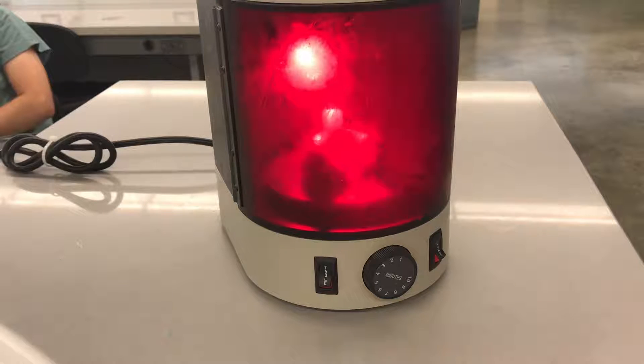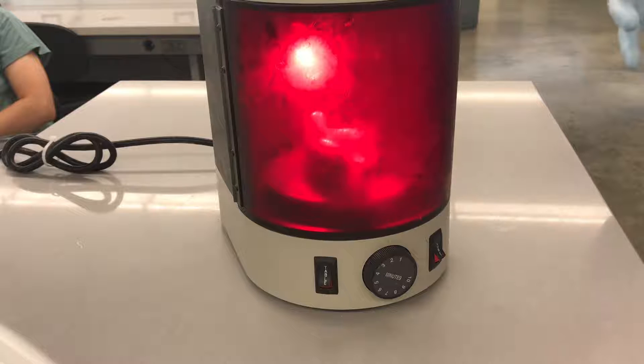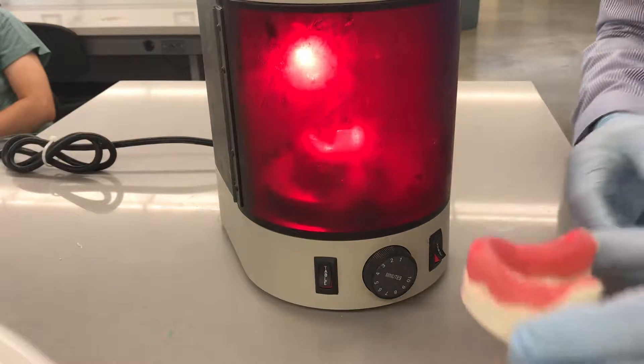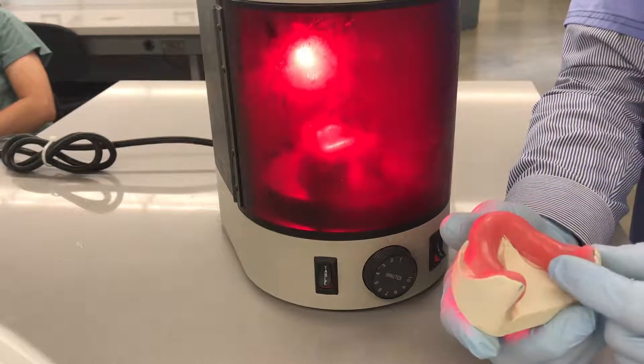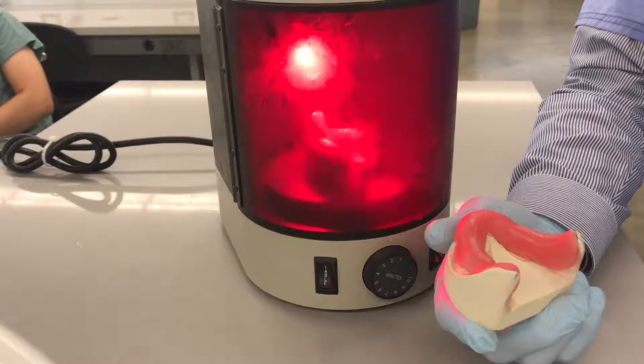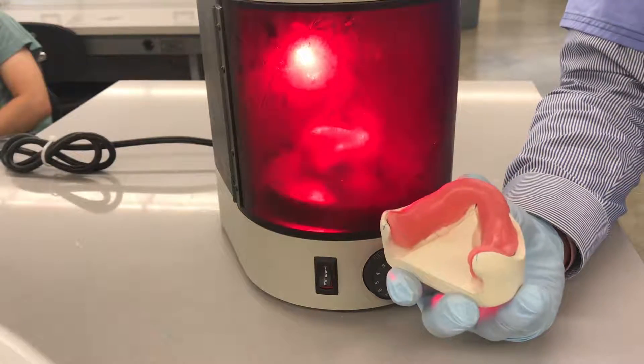In most cases, you're going to have some material that's still soft around the periphery of the tray, because some of the surfaces of the cast block the light source from penetrating it. Usually on the lower, inside the retromolar pad area. So maybe for the lower, you can go a little bit longer, you can go three minutes.